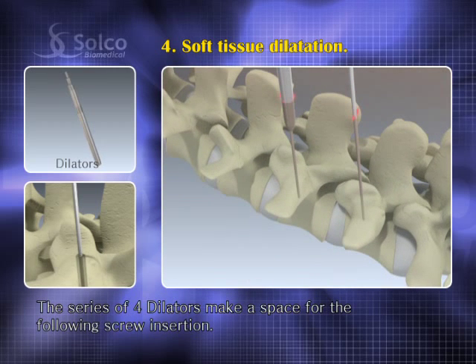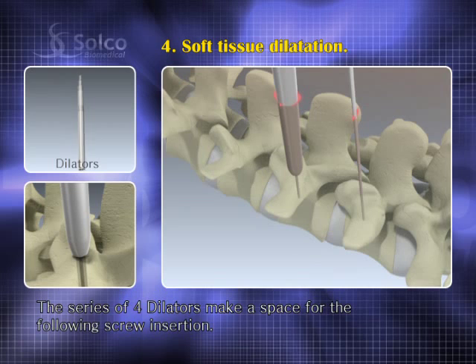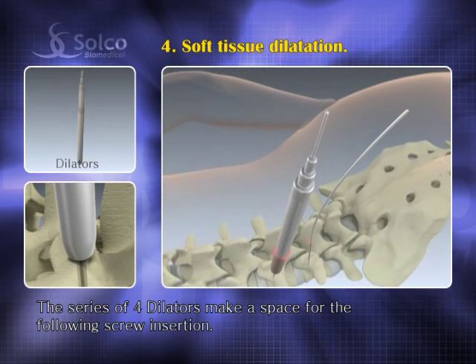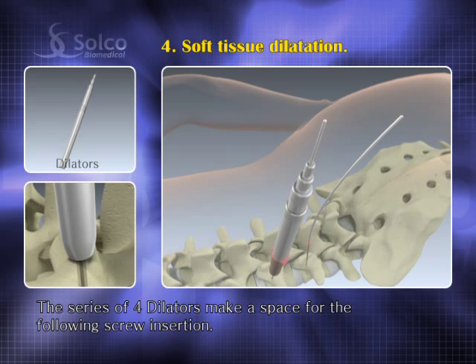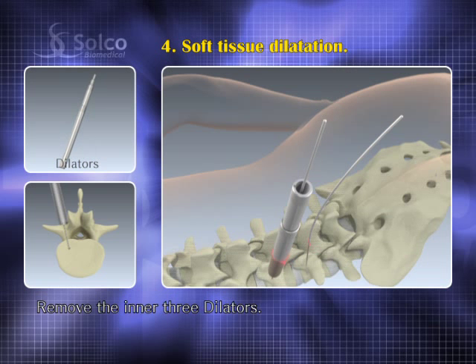The series of four dilators for soft tissue are advanced sequentially from small to large over the guide wire down to the bony surface. This is to make a space for the following screw insertion. Remove the three inner dilators but not the outer one and the guide wire.